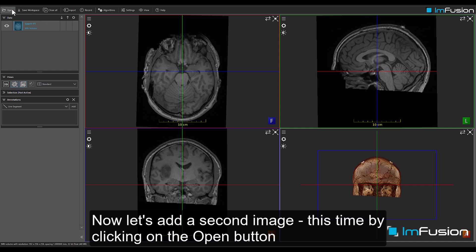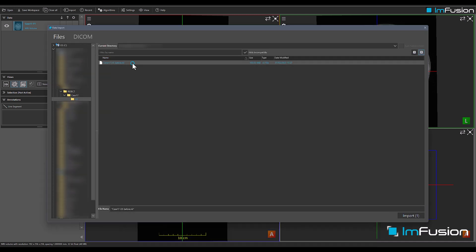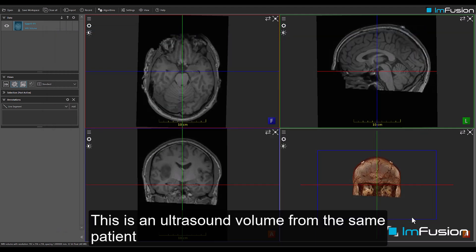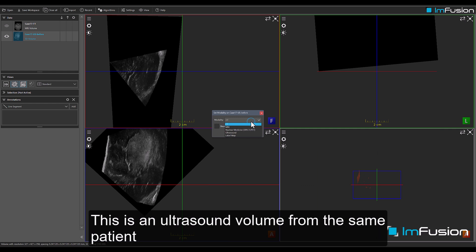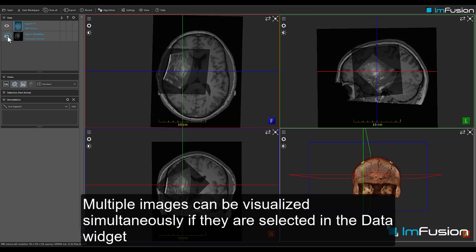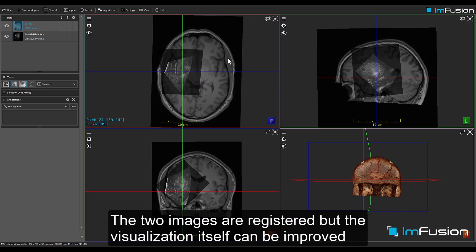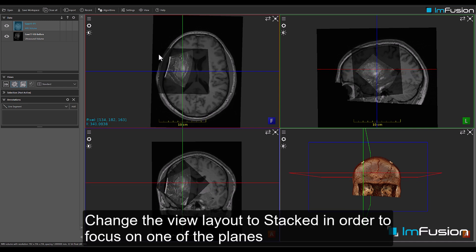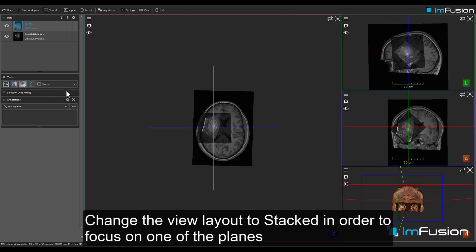Now let's add a second image, this time by clicking on the Open button. This is an ultrasound volume from the same patient. Multiple images can be visualized simultaneously if they're selected in the data widget. The two images are registered, but the visualization itself can be improved. Change the view layout to Stacked in order to focus on one of the planes.